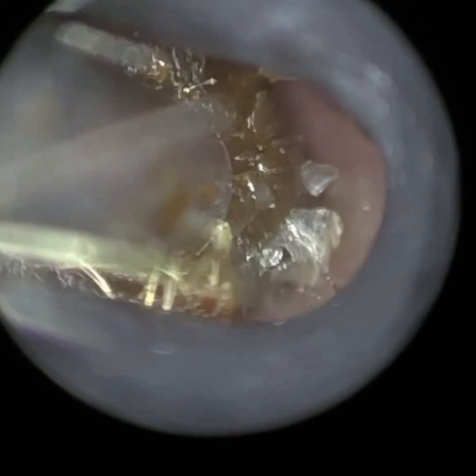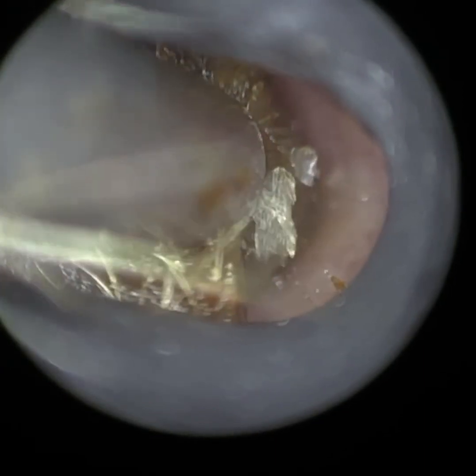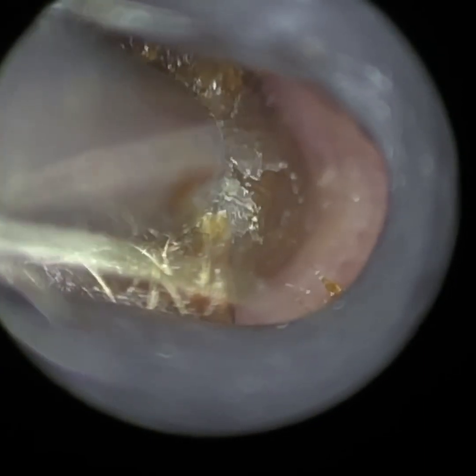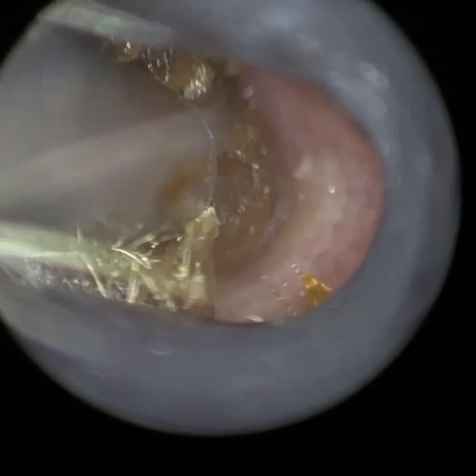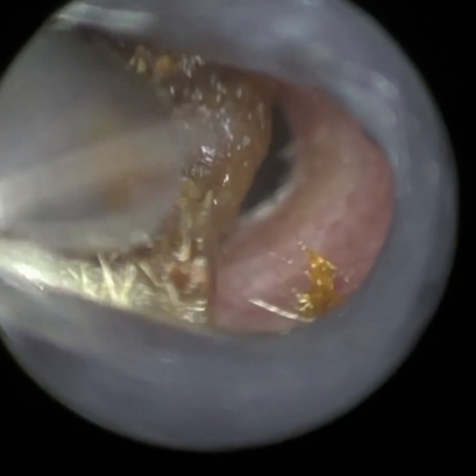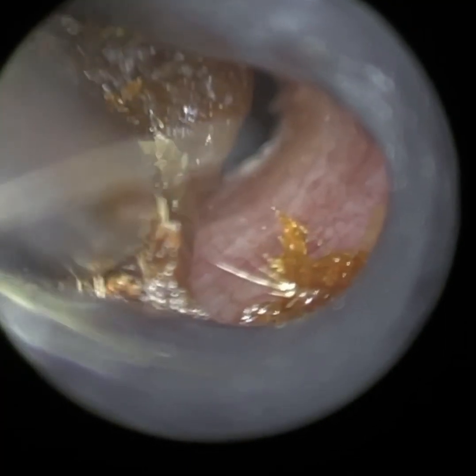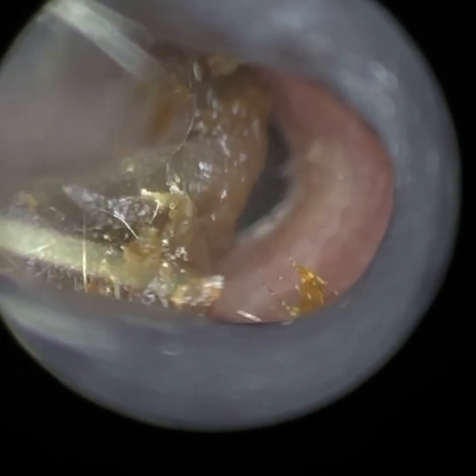With our unique ENT speculum — a UK patent has been applied for — it attaches to the Waxscope directly. If you think about the speculum, you've got the distal tip that goes into the ear, and you've got the proximal end, which is the closest point to us, that clips onto the Waxscope. And in the middle, there's an opening — an intermediary channel — in addition to the slit at the top, and that's where the instrument goes in.